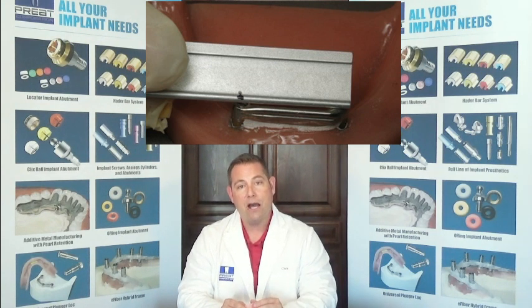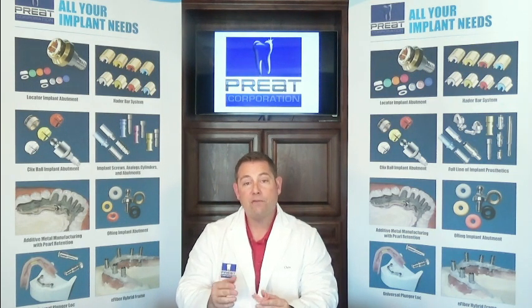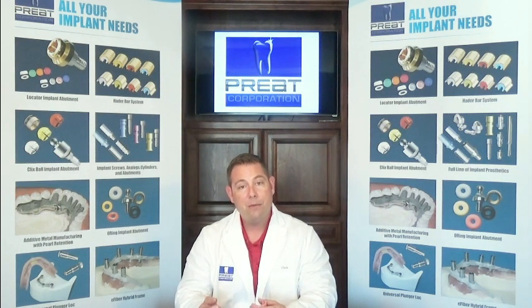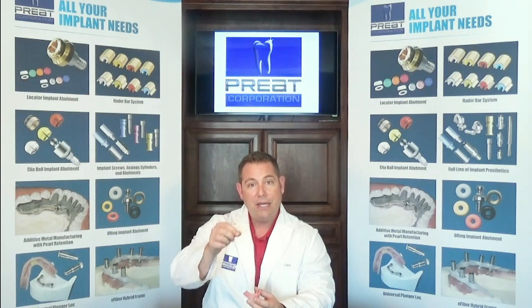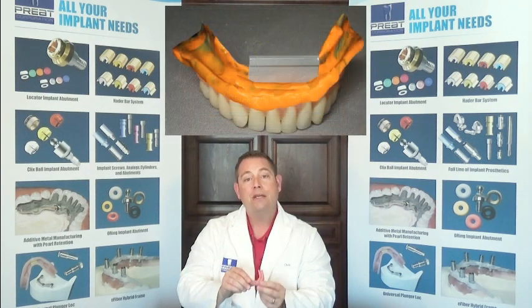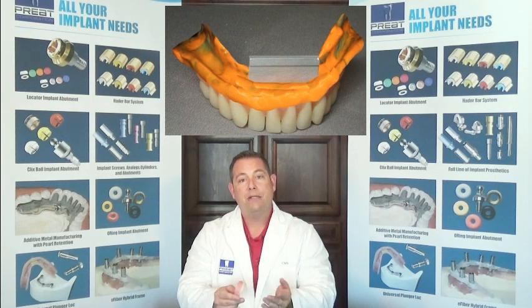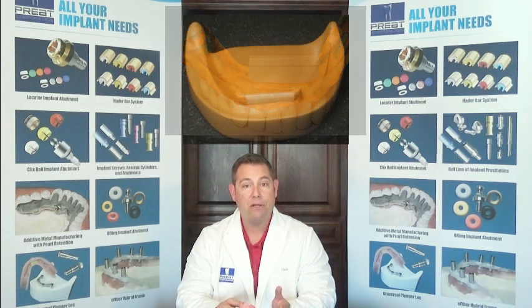The second analog option is a Delrin analog bar. Delrin is an excellent material — you can process acrylic against it and it won't stick to it. Delrin is also easier to manipulate; you can take scissors and cut it, or use a disc. The same protocol applies: cut the Delrin bar down to the length of the segments in the mouth, index those back into the prosthesis, and pour up the cast. Your cast will have the analog bars in place exactly where they are in the mouth.